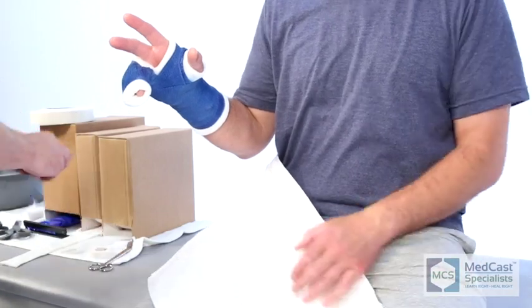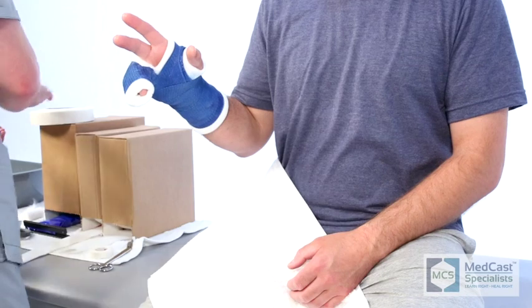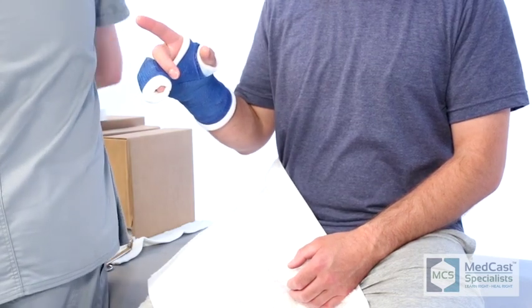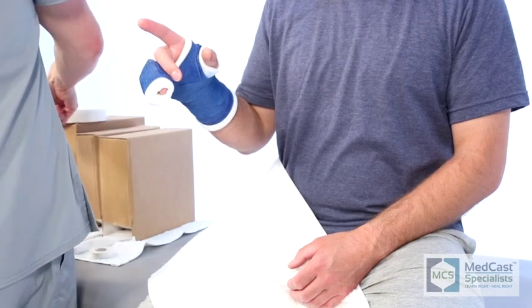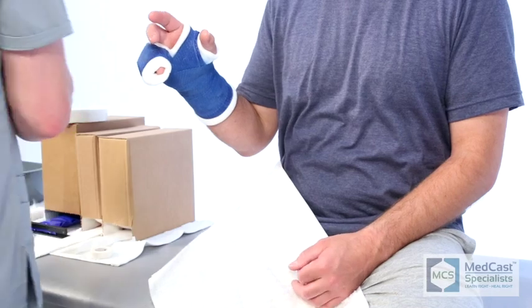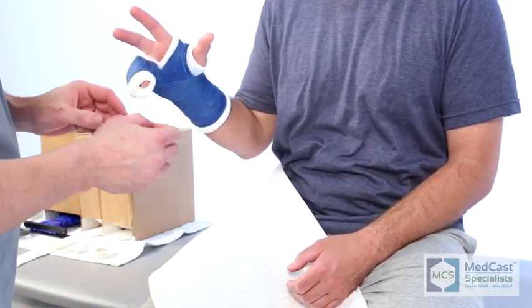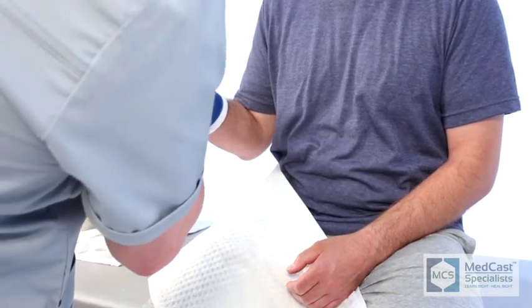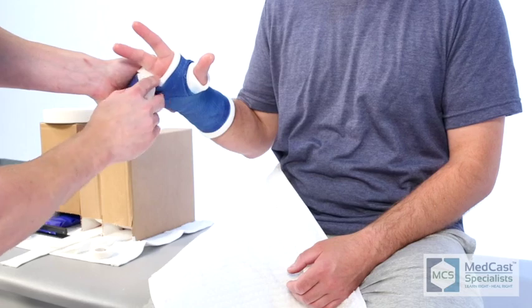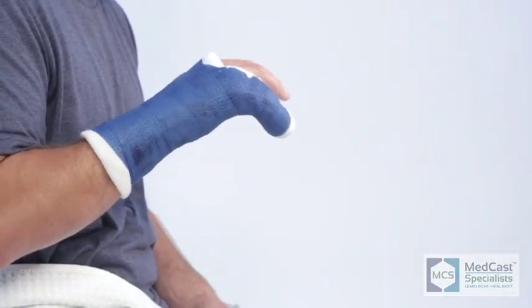As you watch him apply the mold skin for protection, keep in mind that you need to evaluate the type of patient who will be using this cast. After you're done rolling the ulnar gutter cast, first check the patient's range of motion in the digits not included in the cast. Sometimes down at the web space between the non-included fingers you might get a little piece of cast material — use small scissors to cut it out and always pad it up so the finger isn't rubbing on the fiberglass, as it can act like sandpaper and cause abrasions.